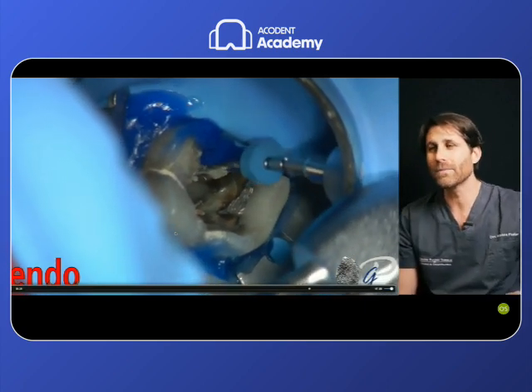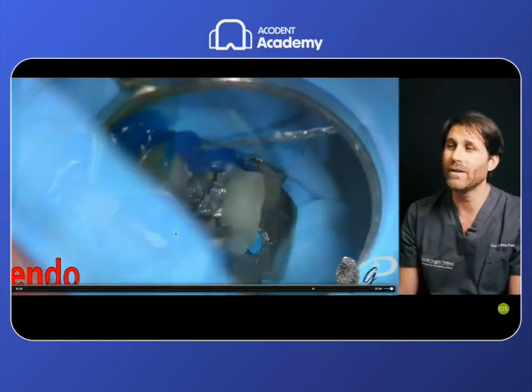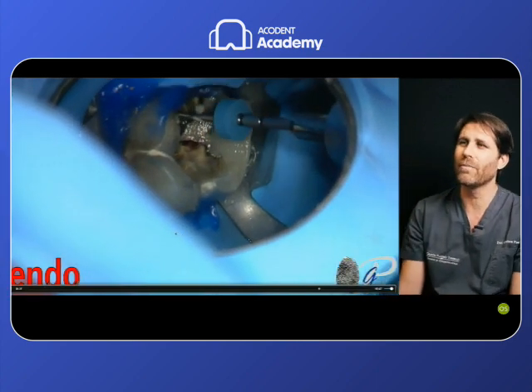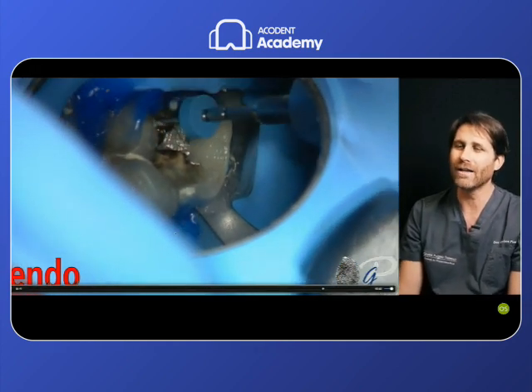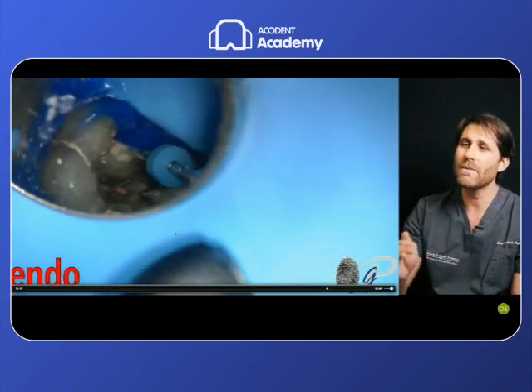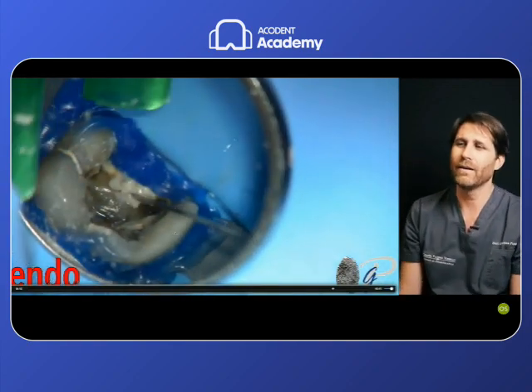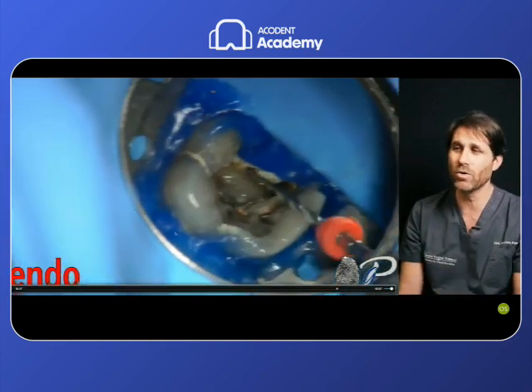So in this case, very difficult. Even if I have scouted the canal with the 10, I like to insert another file before the single file to pre-enlarge the root canal, for a pre-flaring of the root canal, to make life easier for the single file that has to reach the working length. In this case, we created a pre-flaring, coronal, middle, and third, pre-flared and pre-enlarged for the following instrumentation with the real file for the instrumentation of this root canal, that in this case was the Reciproc White.